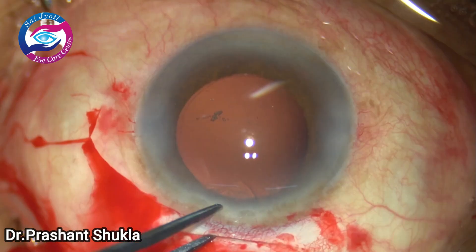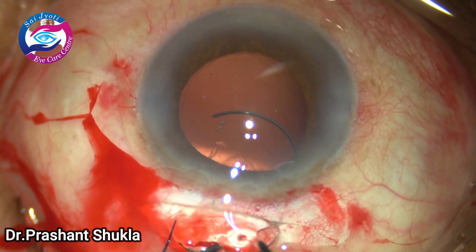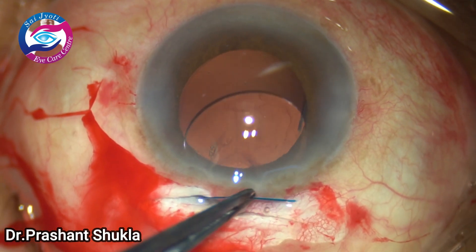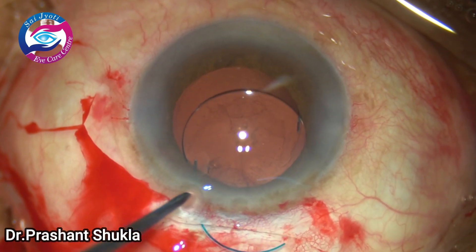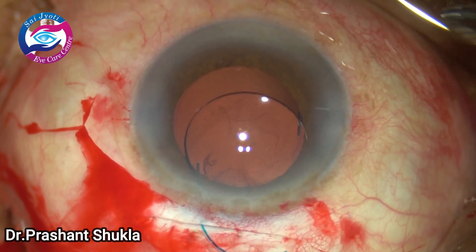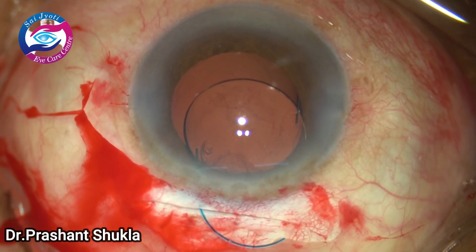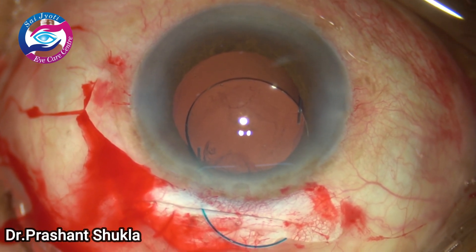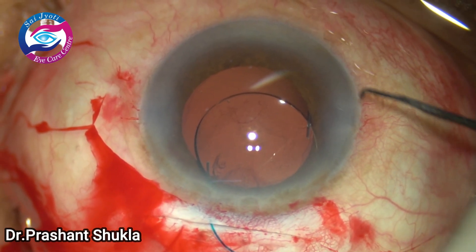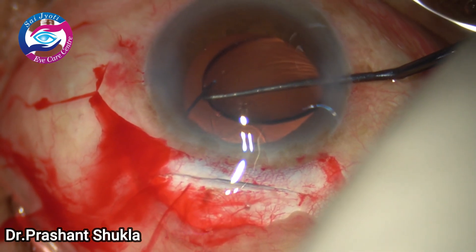Things are going slowly and I am taking a 3-piece hydrophobic intraocular lens. The leading haptic goes into the capsular bag. In this case I had issues dialing the trailing haptic into the capsular bag — as we will see in a moment. I am using a Sinskey hook to grab the optic-haptic junction, but the haptic doesn't get dialed into the bag and stays over the iris.